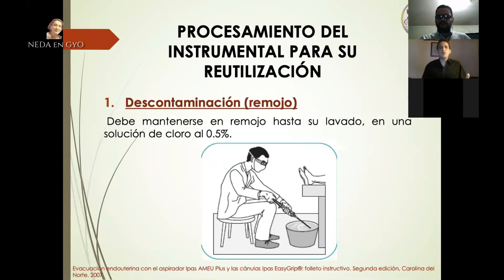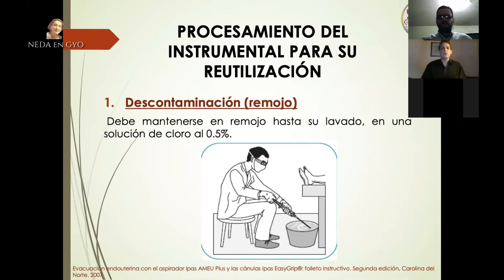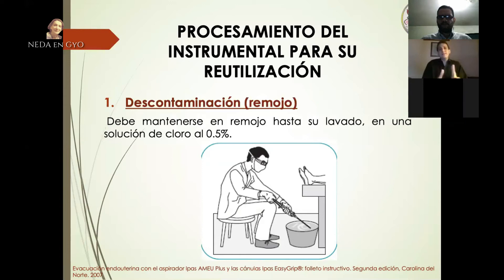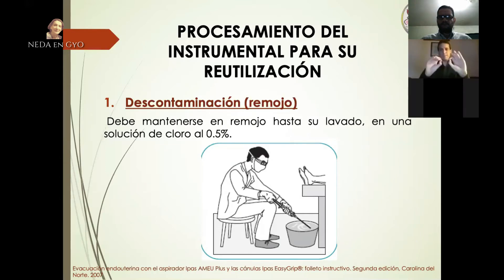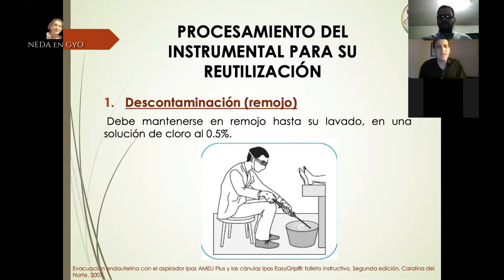En cuanto al procesamiento del instrumental para su reutilización, el primer paso es la descontaminación o remojo en una solución de cloro al 0,5%. Es importante realizarla inmediatamente posterior al legrado con AMEU, porque mientras más tiempo duren la sangre y los restos, más difícil será retirarlos. Cuando se hace recién terminada la aspiración, se pueden retirar fácilmente, y gracias a esto se facilita la técnica de esterilización con menor riesgo de complicaciones e infecciones.